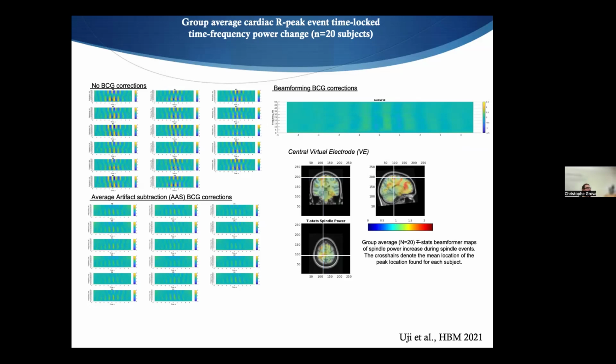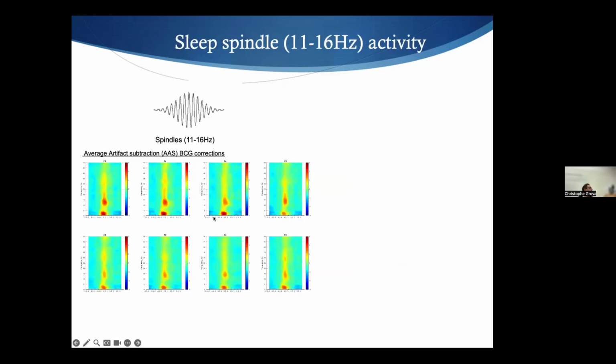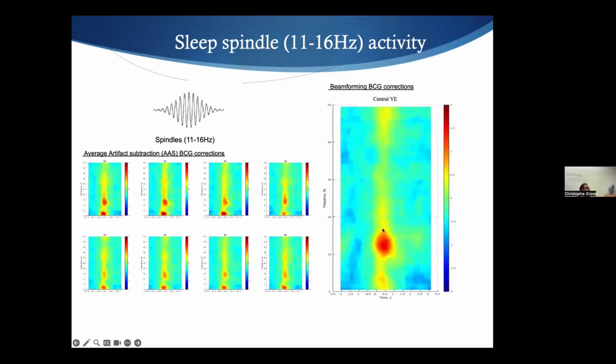Just to give you an idea, this is the kind of time frequency map for the spindles detected by our expert after standard corrections. And this is what we get using the beamformer. Here you see that we removed also some of the low frequency noise, and we have really only our peak in the spindle range. So that was really nice.